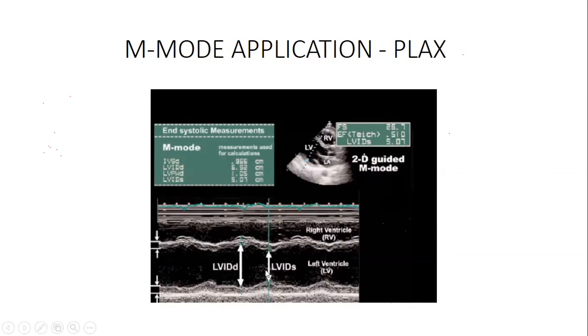I think the objective of this lecture is to first orient you to images. But just to clear you, because I cannot start telling you everything here, it would be too much. We will overload each other. For the sake of explanation, the reason why we are measuring from there to there, a patient comes with just an echo.